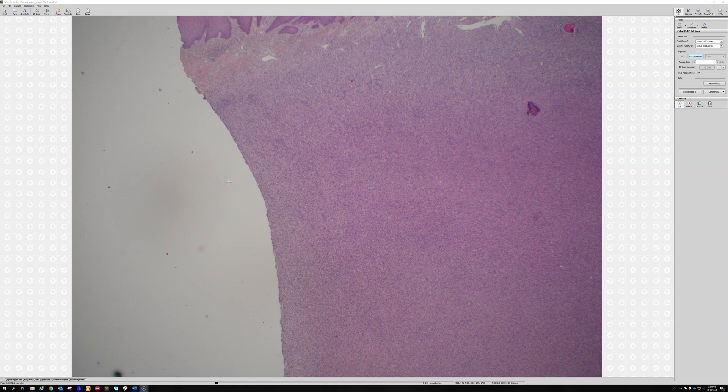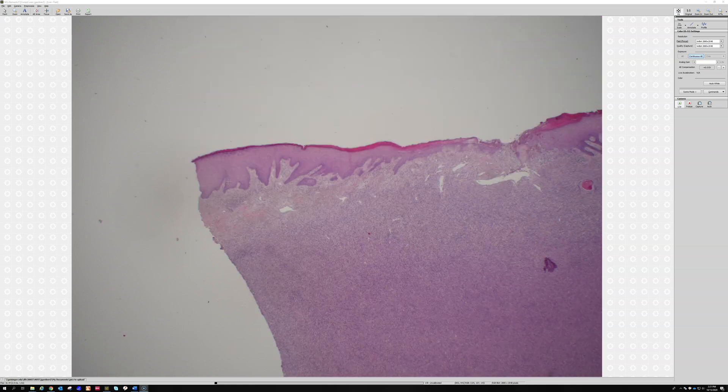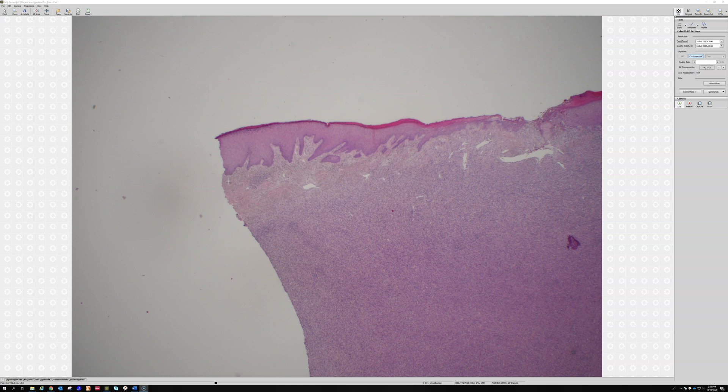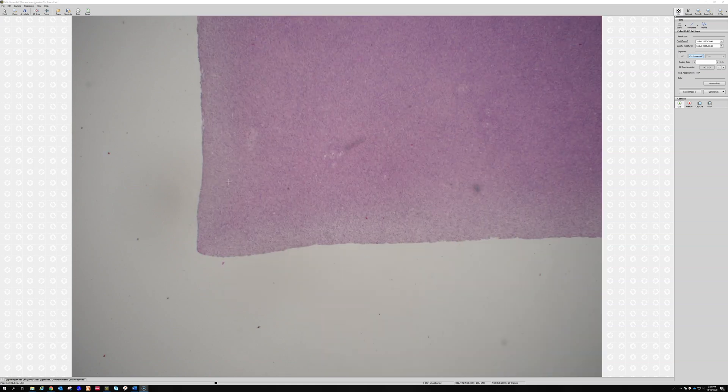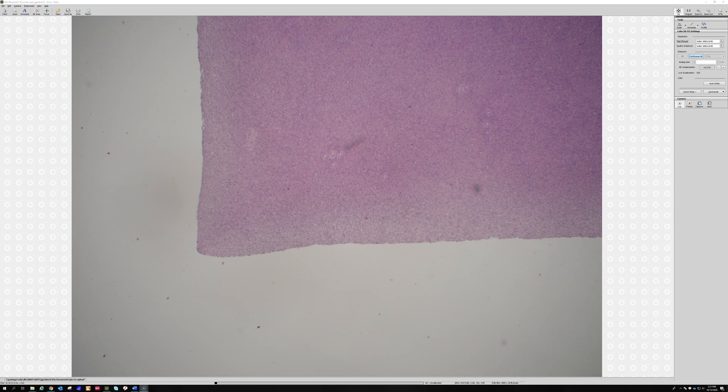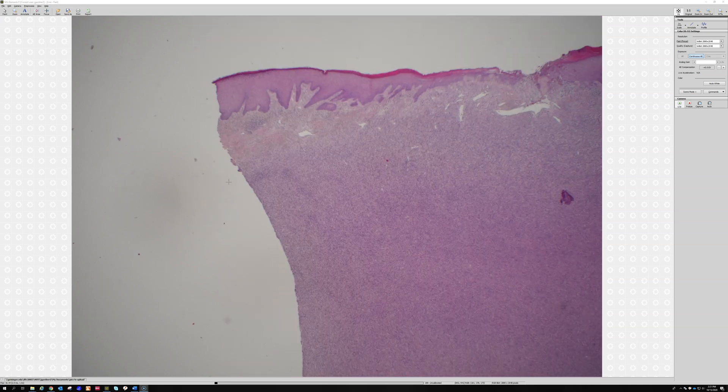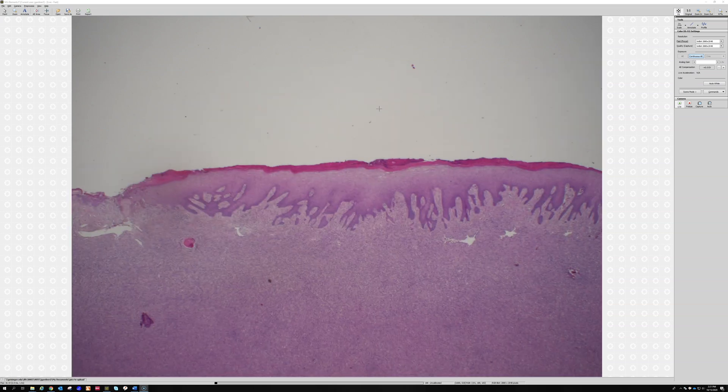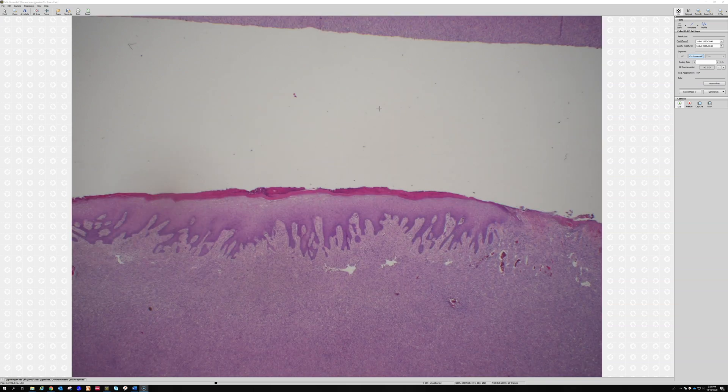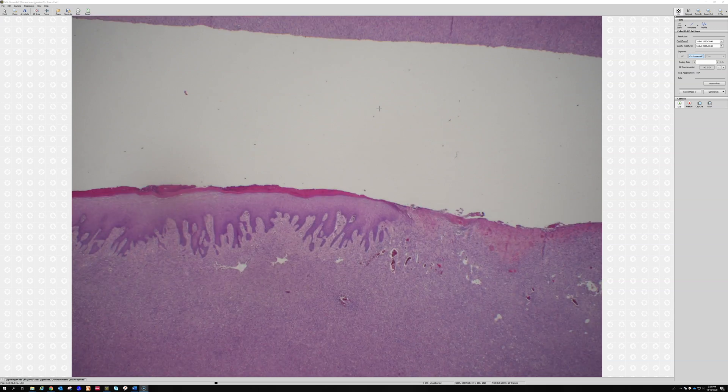For DF and DFSP particularly, those context clues matter to me at first more than what the cells actually look like. Obviously I do go look at the cells, but what I start with is looking: what's the epidermis doing, what's it doing with the peripheral collagen, what's it doing with the fat down below. I can't see really any of that here. One way you can look at that is sometimes you get a little clue if you have a bit of dermis, you can see sometimes if that epidermis has hyperplasia, which this does.